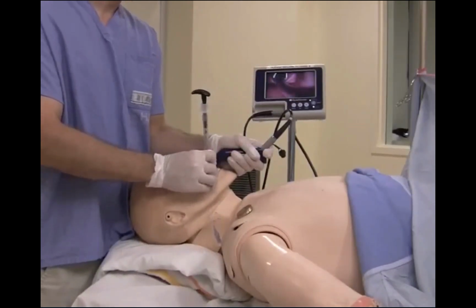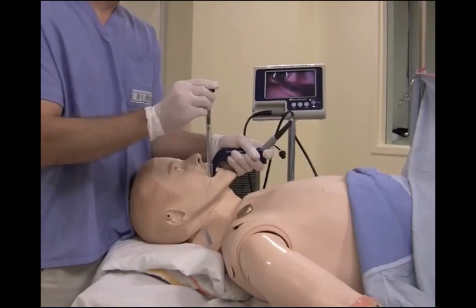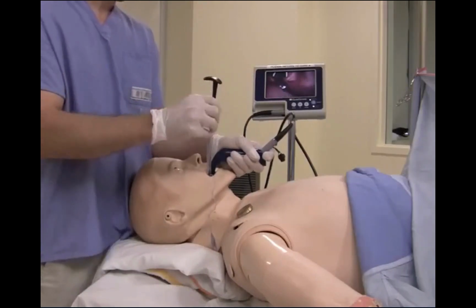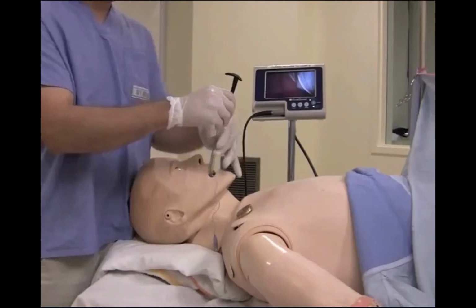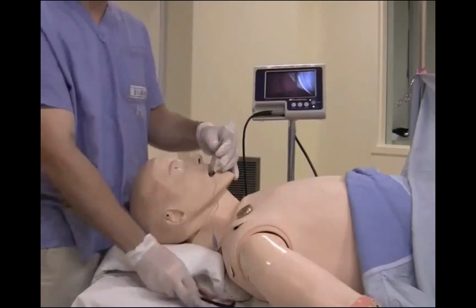Once I enter in through the vocal cords, then I will have an assistant pull back my stylet and I will continue to advance the endotracheal tube. From here, I will remove the Glidescope handle. I will put air in the cuff of the endotracheal tube, and then I can secure the endotracheal tube appropriately.